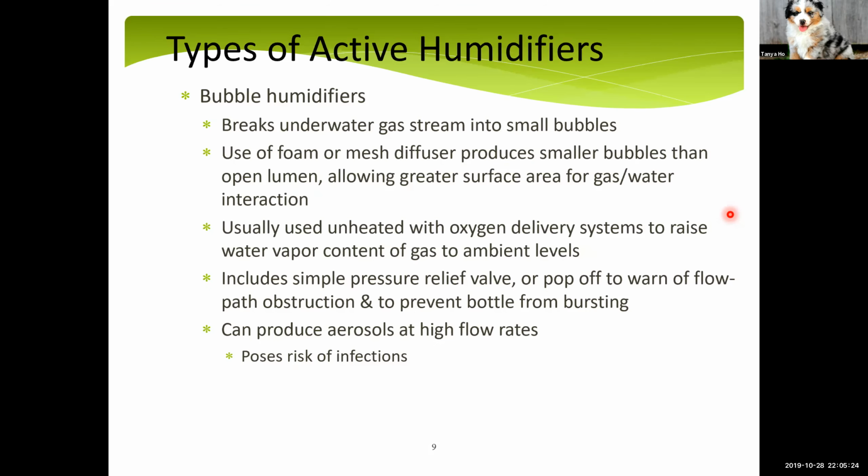Okay, so this is what I was talking about. The bubble humidifier, the gas stream breaks up into the small bubbles. There's like that little foam or filter thing that I was referring to in the previous slide. It produces smaller bubbles. And so because there are more smaller bubbles, the surface of each bubble can come in contact with the water, which is the surface area piece, and then how long it spends floating through the water is the time of contact piece.